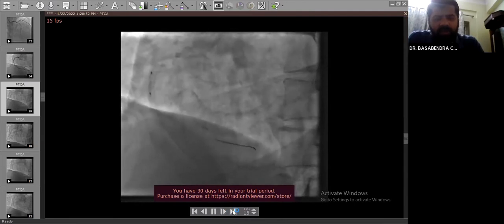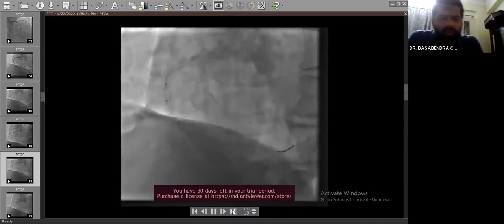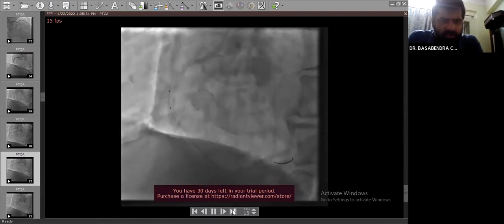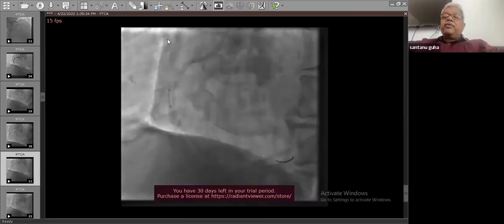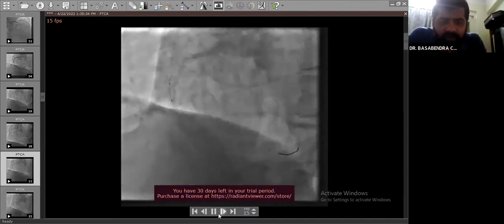And then we took a lower profile balloon, a 1.5 into 10 balloon. But this balloon also did not go to the distal RCA. We could not cross the calcific distal lesion. But you're unable to see it properly. Seeing a part of it, but it is too big. Yeah, this is better.